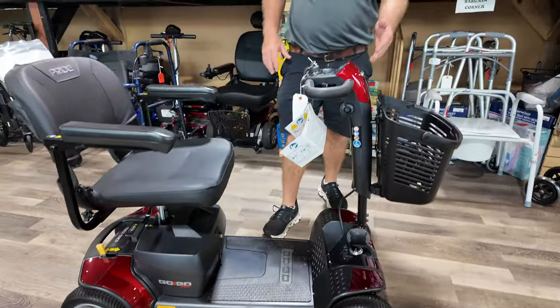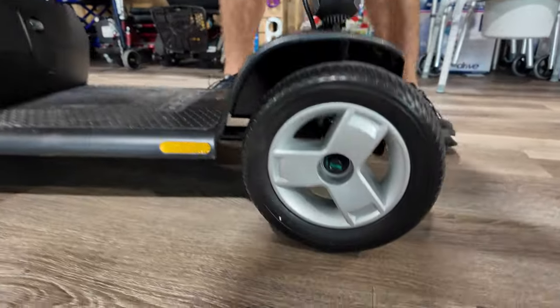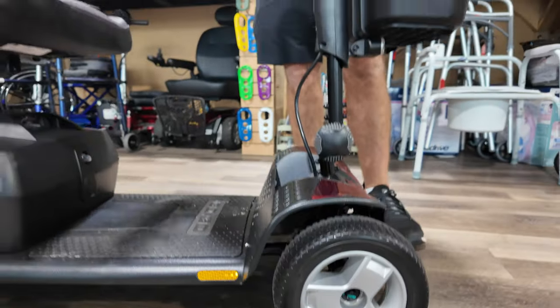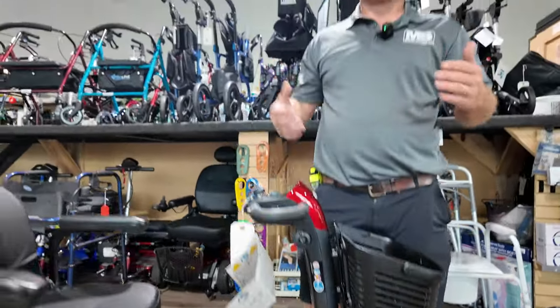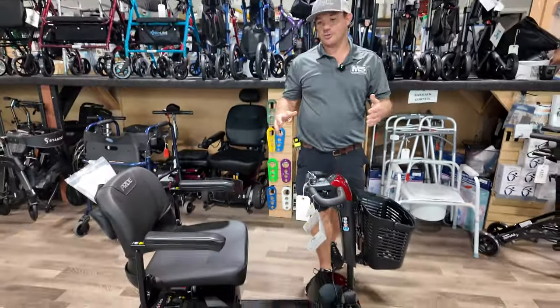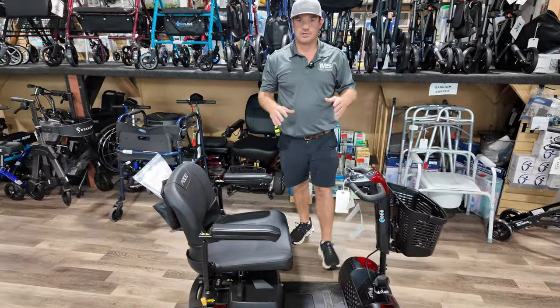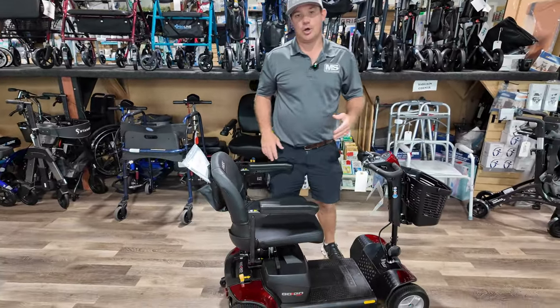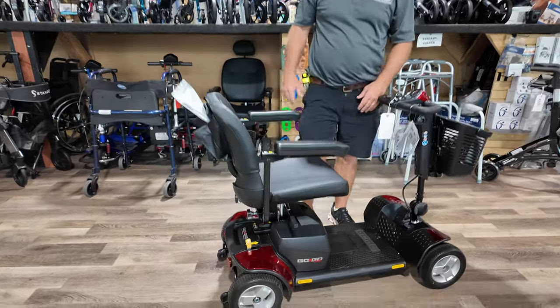It's got larger tires at the front, so this is going to be a good unit that's portable but you're going to be able to use this at parks and similar places — better than any other GoGo for that. It also has the 325-pound weight capacity and it's going to come with the larger batteries, which will give you extended range.